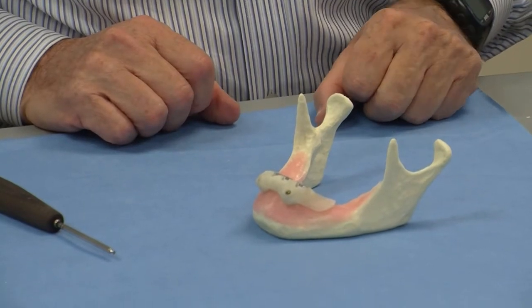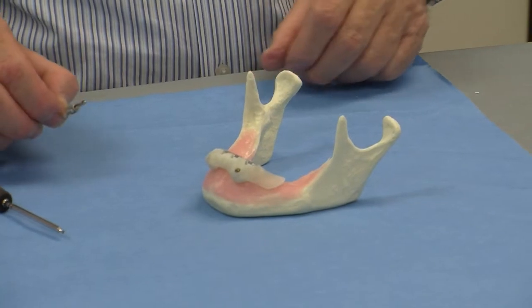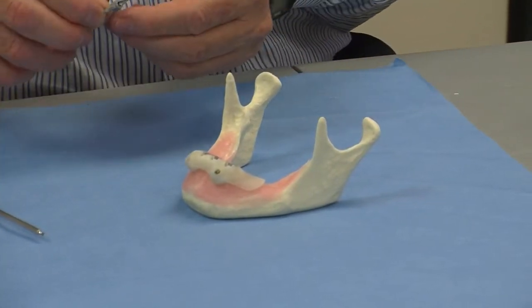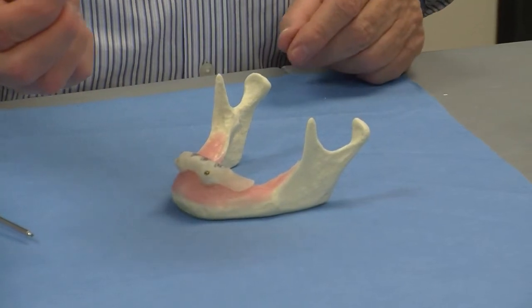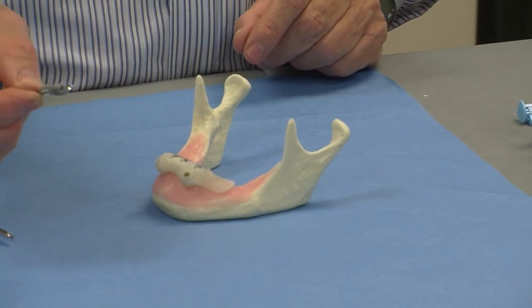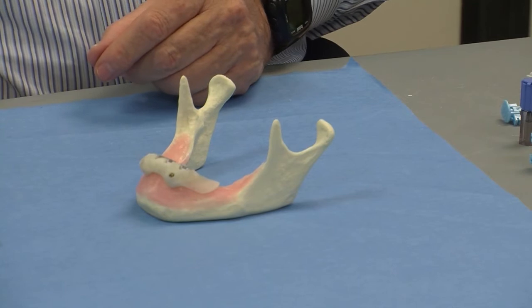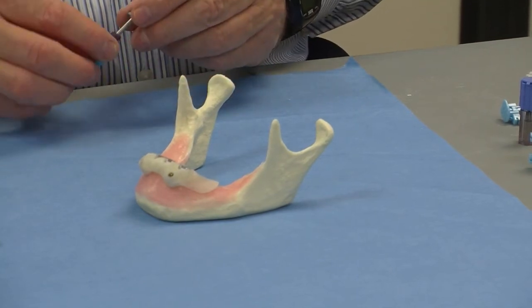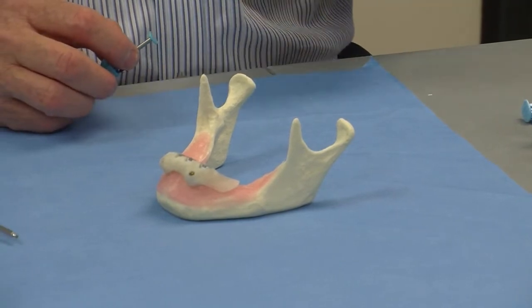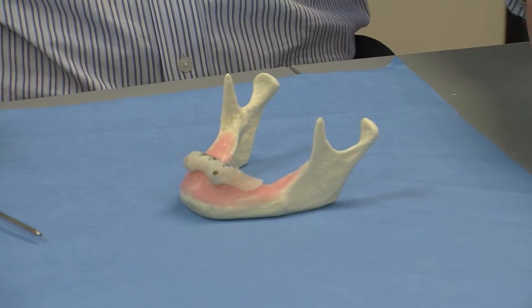Then we have to pick the right guide. We are going to place a 2.9 Zest mini implant. For that purpose, we will use the dark gray guide with a cortical perforation of 2.8. Prior to that, we are going to trim the gingiva to facilitate the insertion of the locator attachment post-surgery.